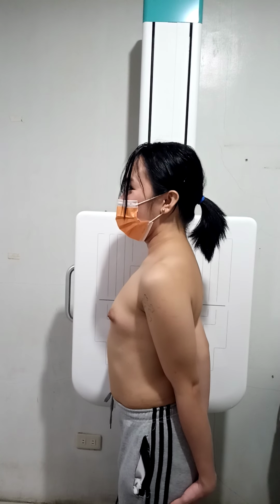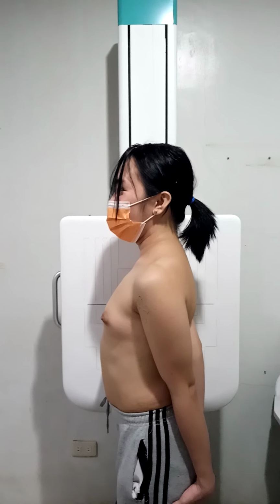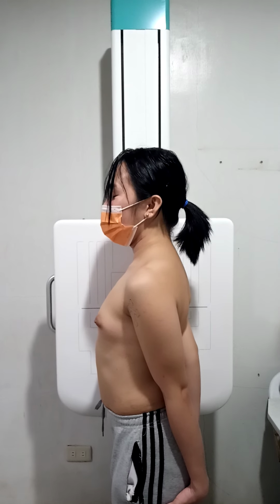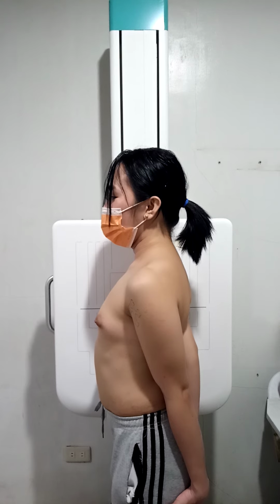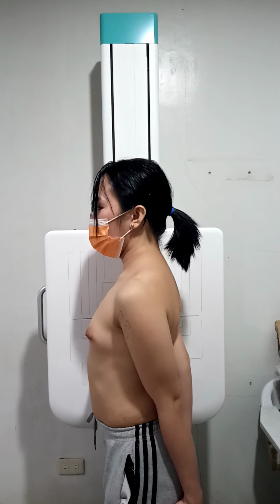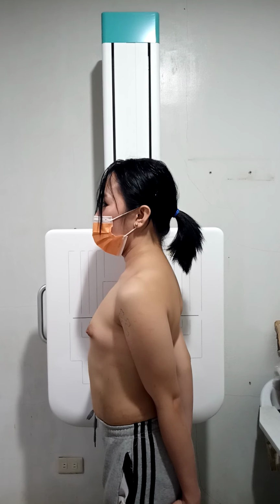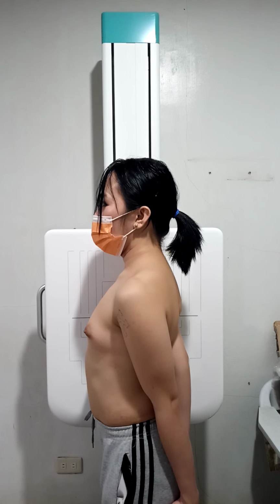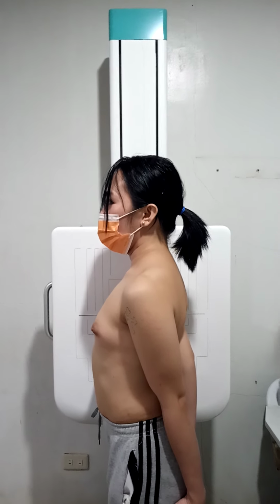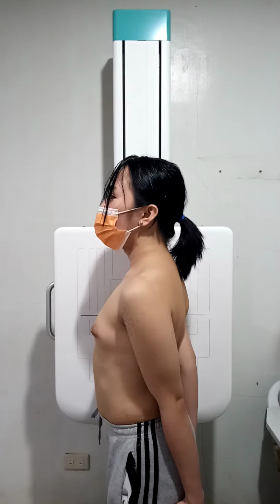In respiration, instruct the patient to suspend breathing on deep inspiration before exposure. Then the central ray must be perpendicular to the center of the IR, entering the lateral border of the mid-sternum, and use an SID of 72 inches or 183 centimeters. The cassette that we're going to use here is 10 by 12 inches or 24 by 30 centimeters. Then collimate at 10 by 12 inches. Then place the side marker in the collimated exposure field.